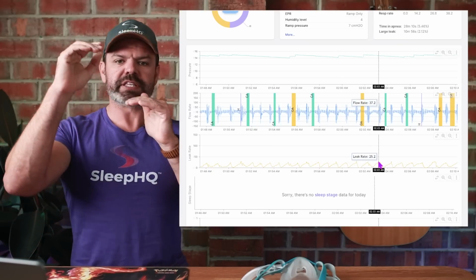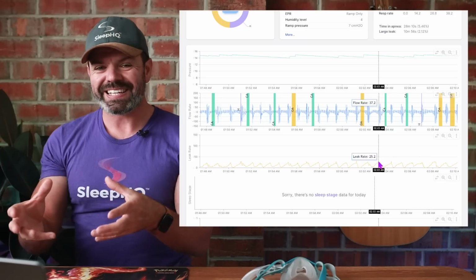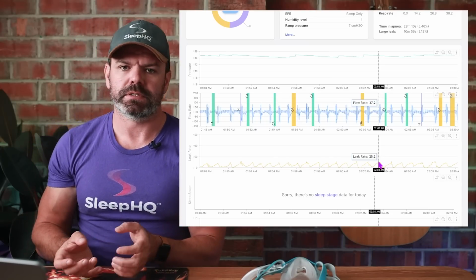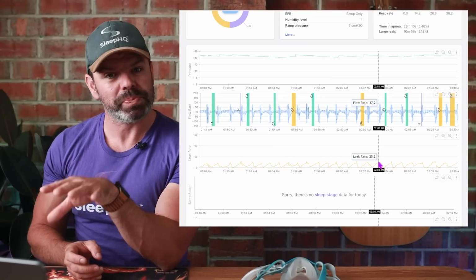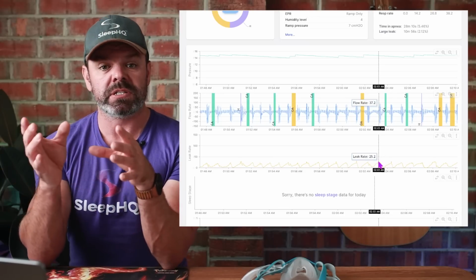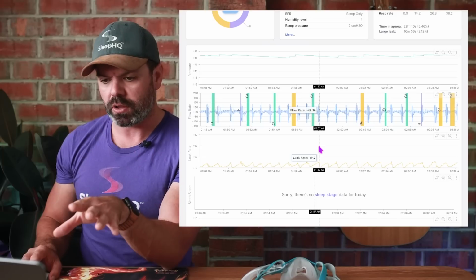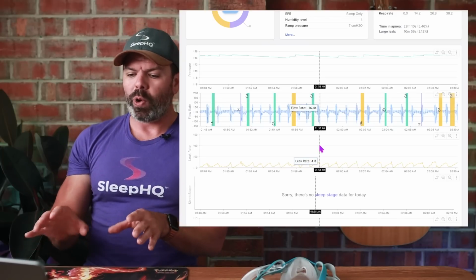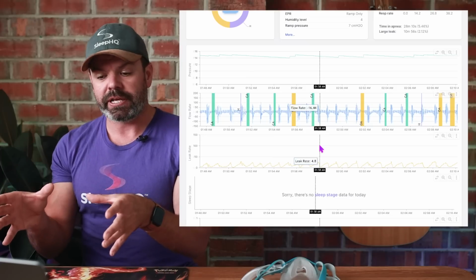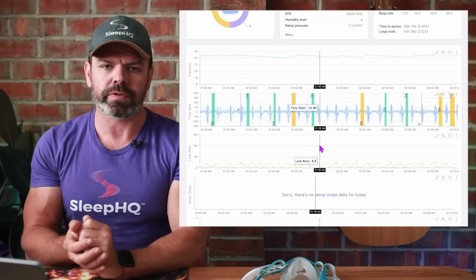However, it's sort of bridged that threshold that ResMed has set at that sort of 24 liters per minute. Once it gets up to that level, the ResMed can no longer mark the respiratory flags, these OAs and the CAs and the hypopneas, with statistical accuracy. And you can see that right here, completely wrong with a lot of flags missed. And when it can't mark the flags accurately, what does it do? It affects the pressure changes of the automatic algorithm.